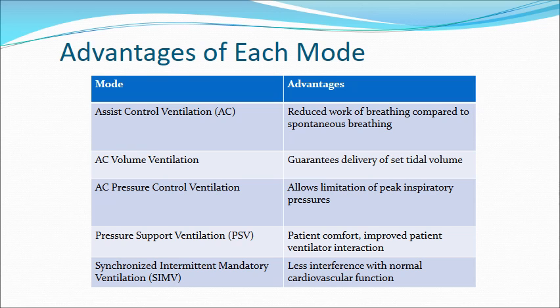The pressure support ventilation, basically we're talking about CPAP. That's for patient support, patient comfort, improved ventilator interaction, but really only for patients who have recovered and are not machine dependent. And synchronized intermittent mandatory ventilation, SIMV.